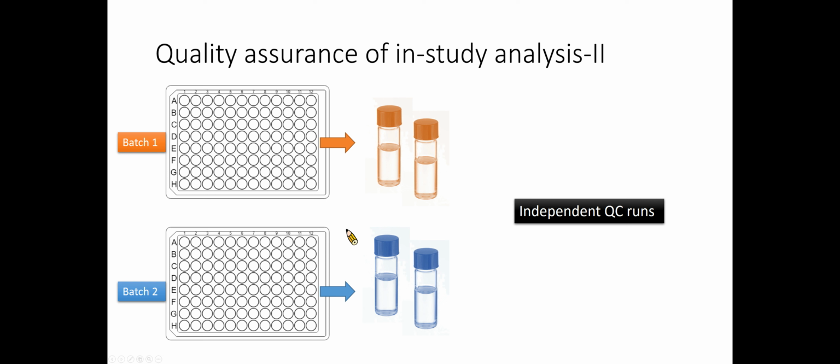If the bioanalytical method necessitates separation of the overall analytical run into distinct processing batches, for example, groups of samples processed at distinctly different times or by different analysts, each distinct batch should process duplicate QCs at all levels, along with the study samples.